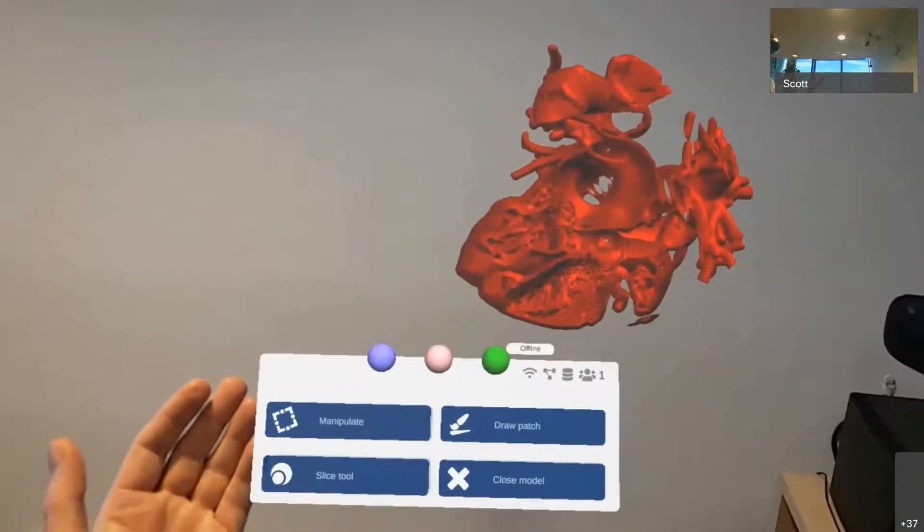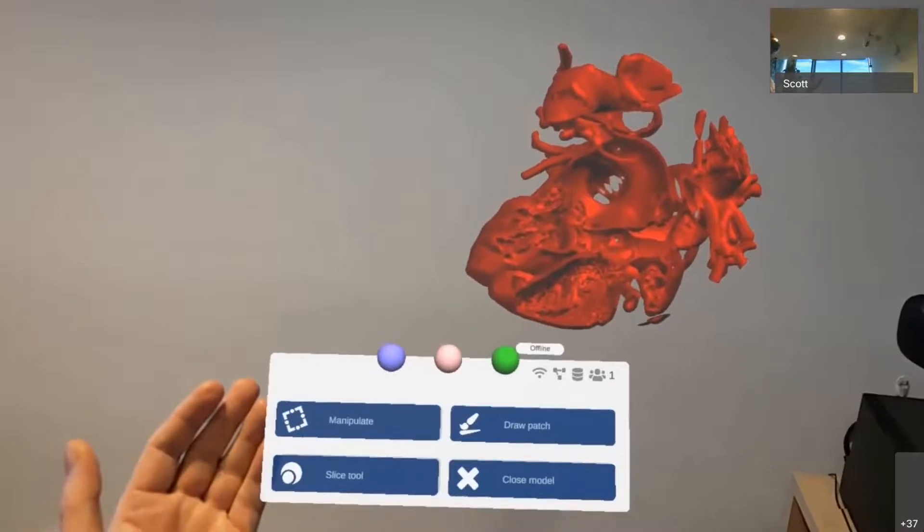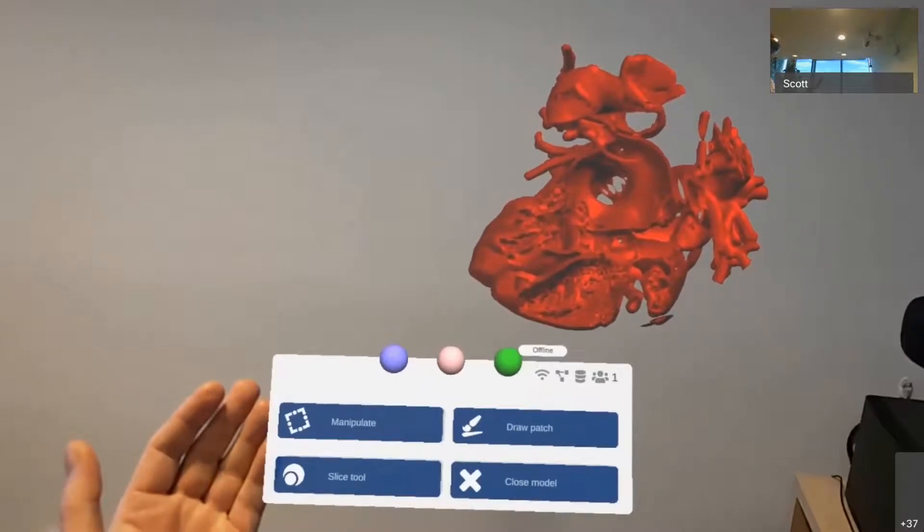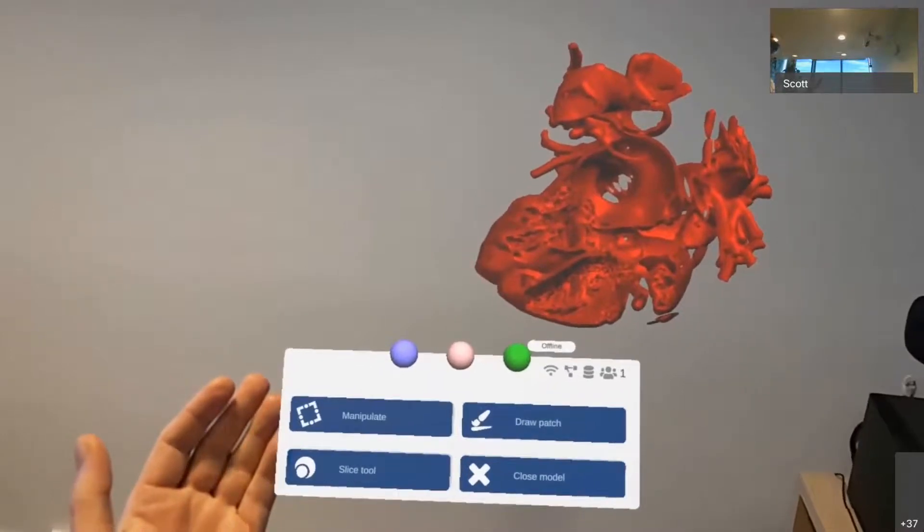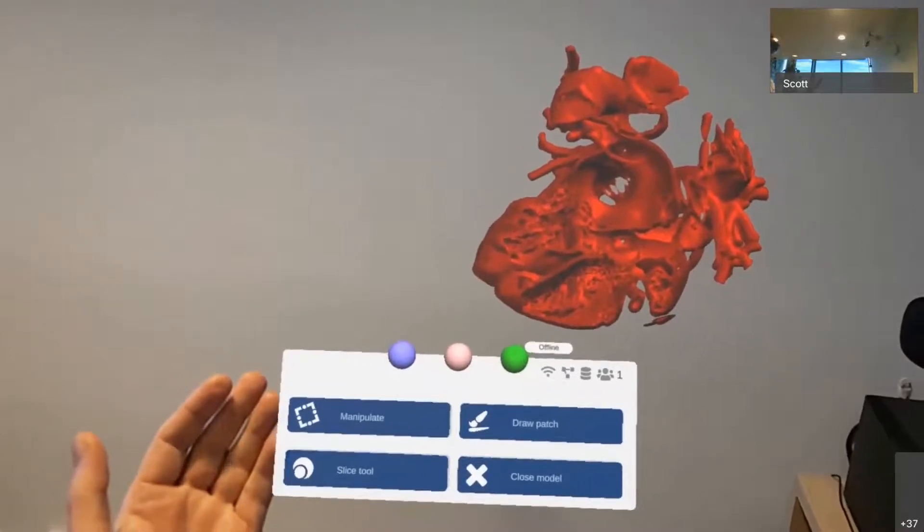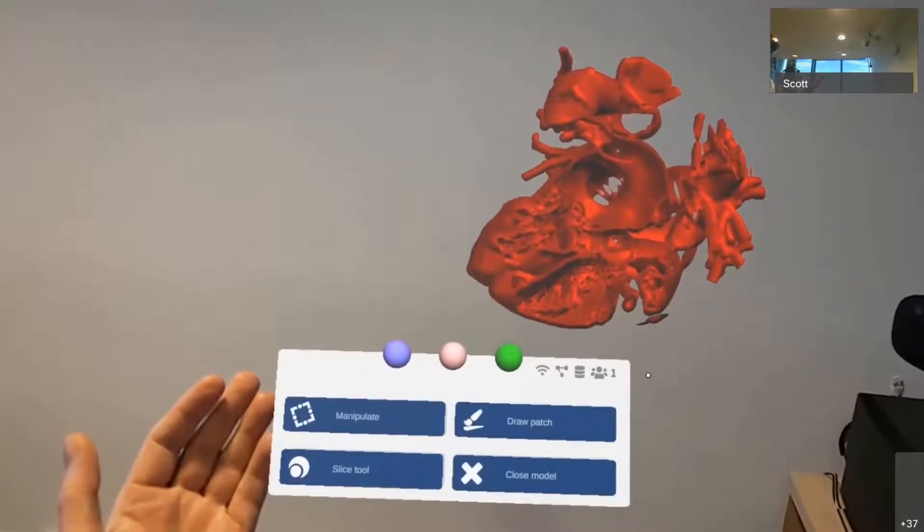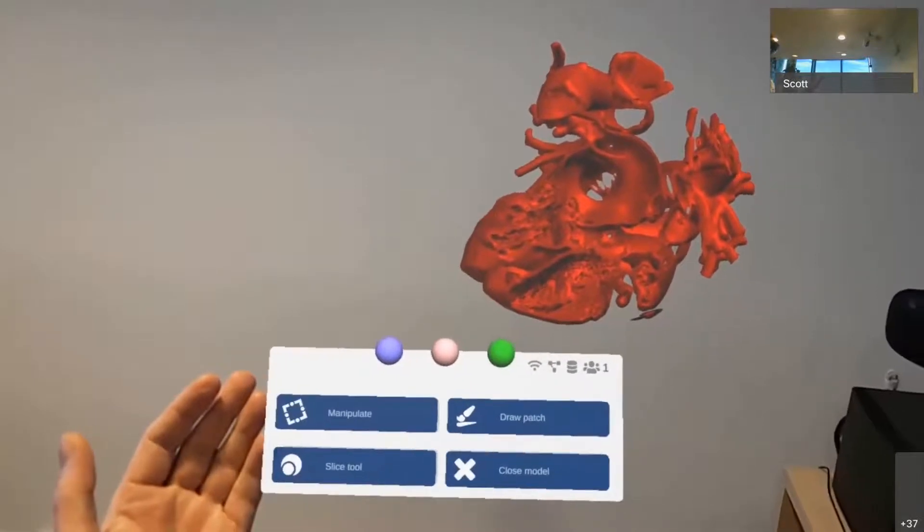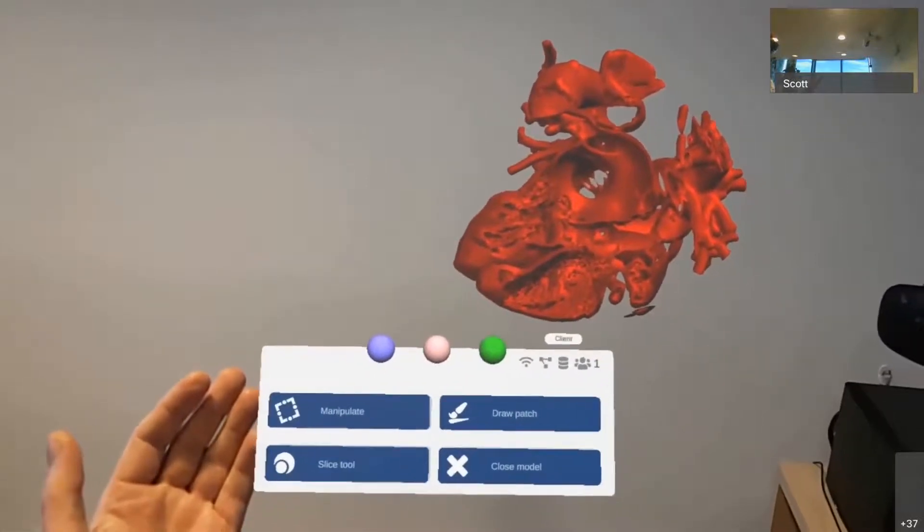And the HoloLens 2 has also got eye tracking. So as I look at the status icons in the top right of the context menu, it gives little pop-ups indicating that it sees what I'm seeing and provides more information.